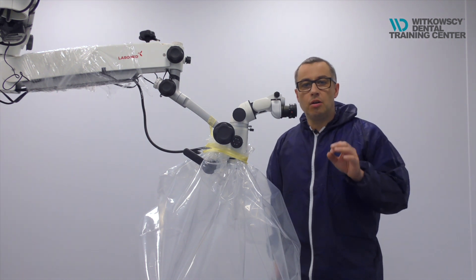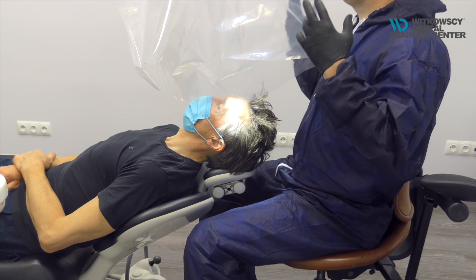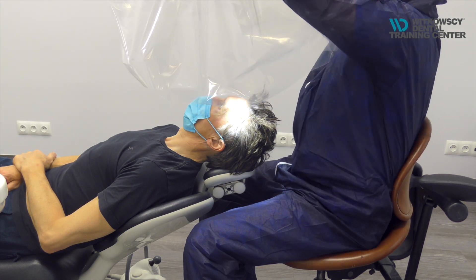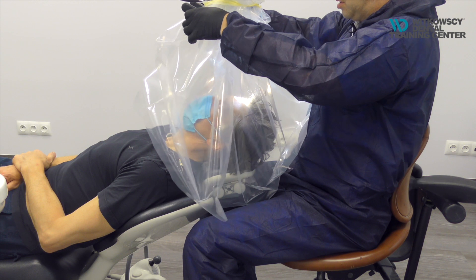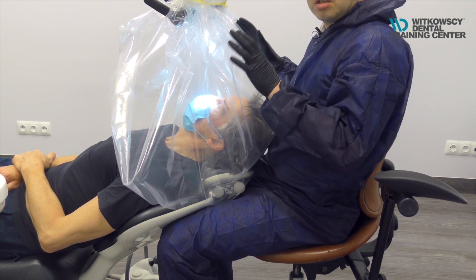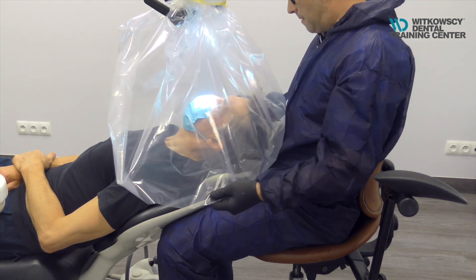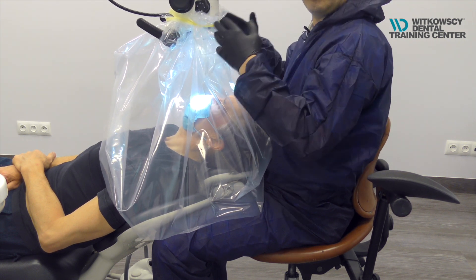Let me show you how it looks in the real situation when you treat the patient. Now we are ready to use our microscope and start working. What you do is inform the patient that you will use the special plastic tent. Then, when everything is set, you move your microscope down and position it in the work position. This is just a demonstration, not a real treatment — the patient is in the mask. When you move the microscope down, you position yourself, sit down, and you can work properly.